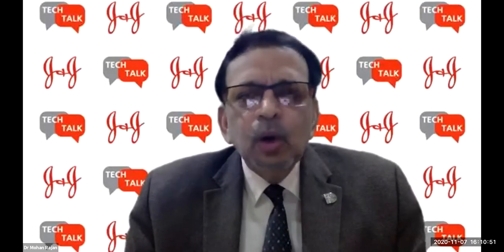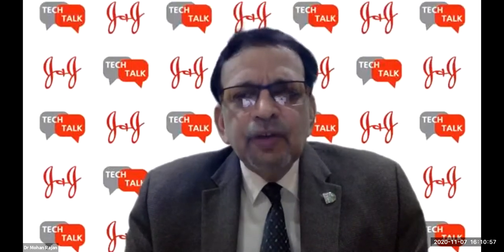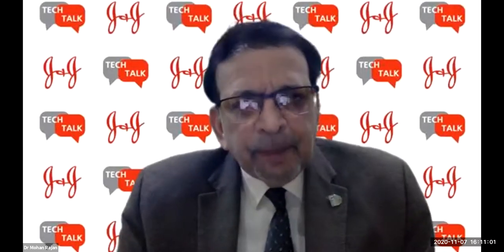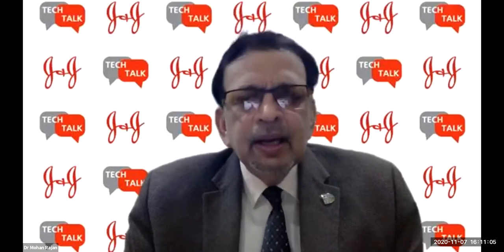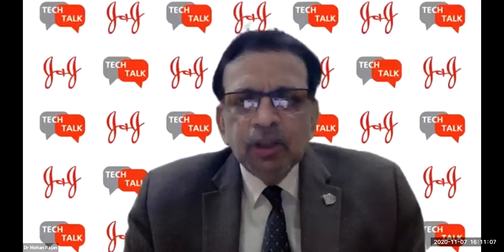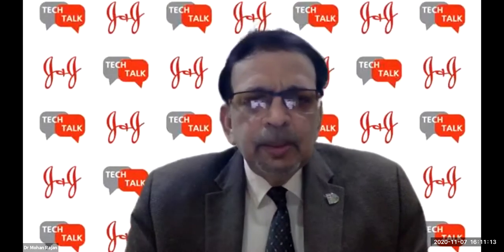I couldn't put a lens. So I think you have to tell the truth, and there's nothing wrong in telling the complication, because if you're going to have the complication and you're going to hide something, you're adding fuel to the flame. And this is a message which I want to give everybody, whether it's beginners or practicing ophthalmologists or veterans. I think it's very important to keep the ego at the back, but not bring it to the front at all.